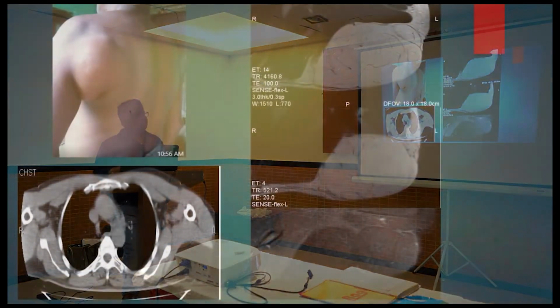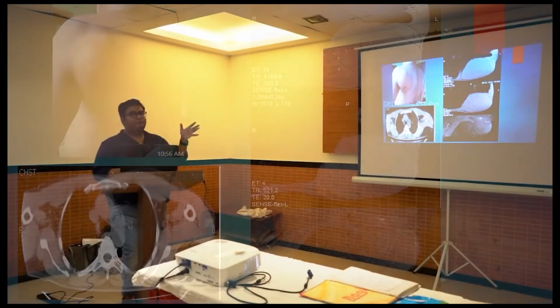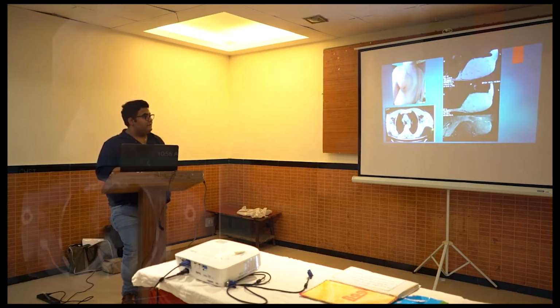There was this patient who came into our clinic with a swelling in the subscapular region on the left side. We did a sono for this patient, small part. It was hyperechoic, which was representing fat. Yet for this session, we did separate studies. So we did a CT. CT showed a hypodense lesion, which was well defined in the left subscapular region.